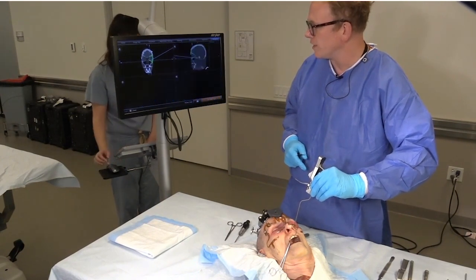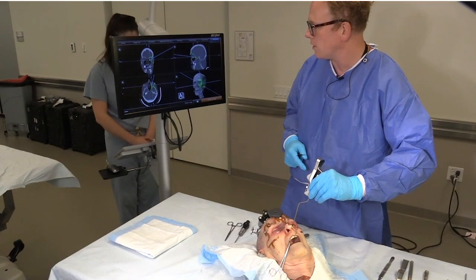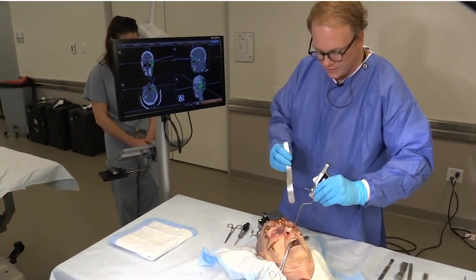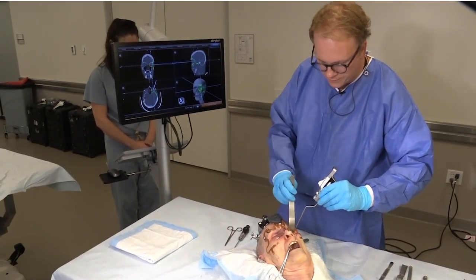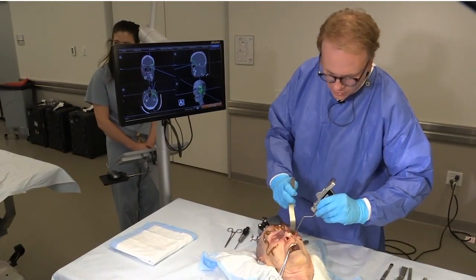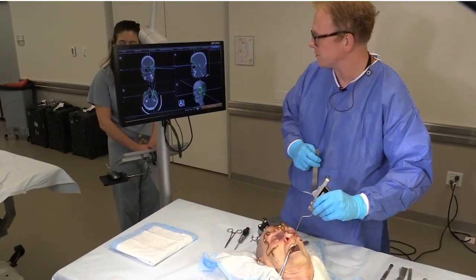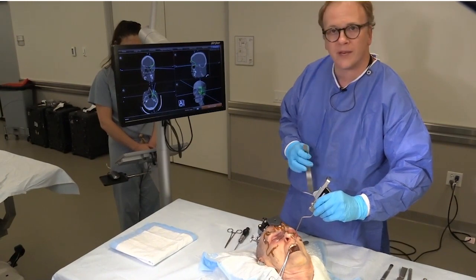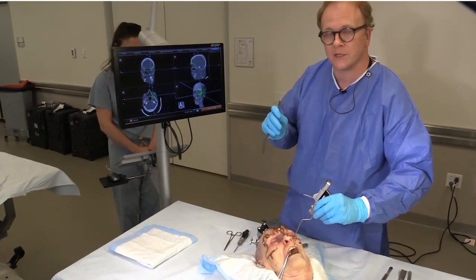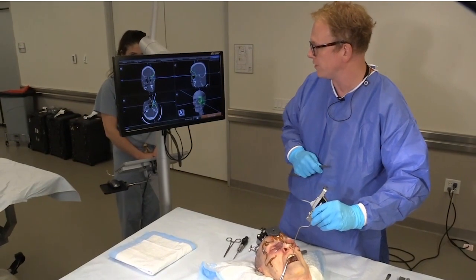If I move the implant into the correct position and my probe sits on the implant where I want it, then I'm in a good spot. In most cases, you'll find that the implant falls off the posterior lip and sits in the sinus. Occasionally, you'll find the implant is sitting too high and encroaching on the orbital apex — and you'll have the opportunity to correct that before you leave the operating room.